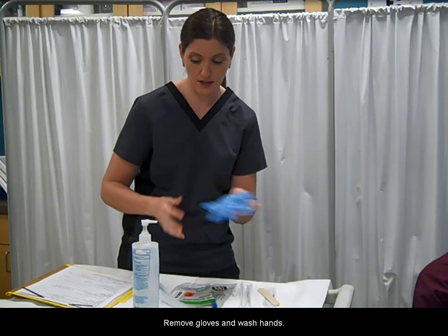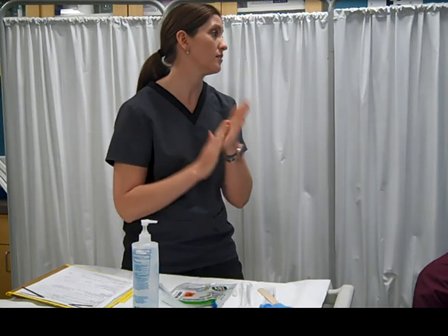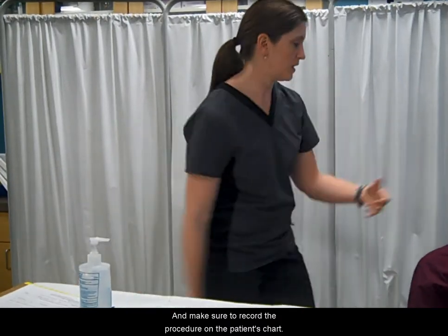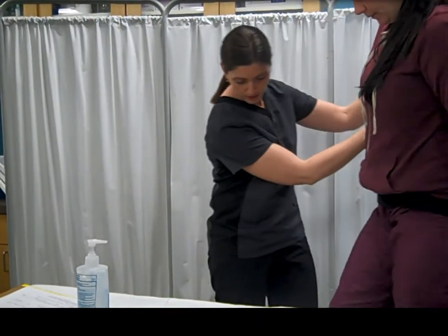Remove gloves and wash hands. Assist your patient down as needed. Make sure to record the procedure on the patient's chart.